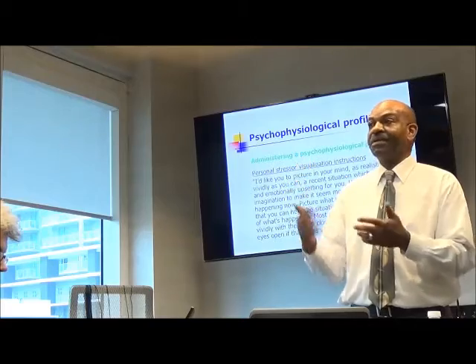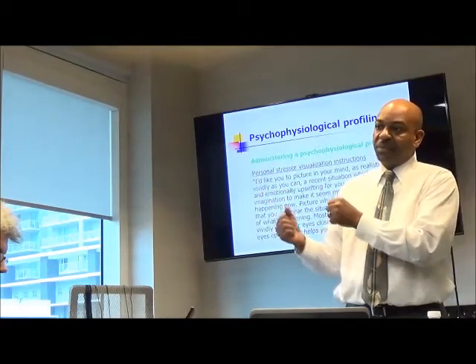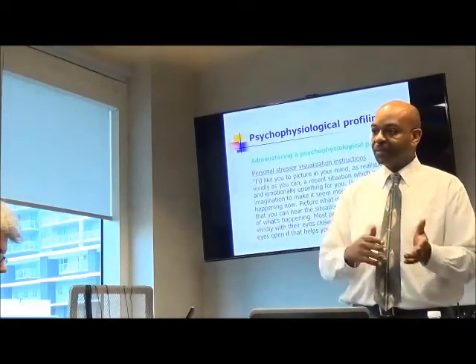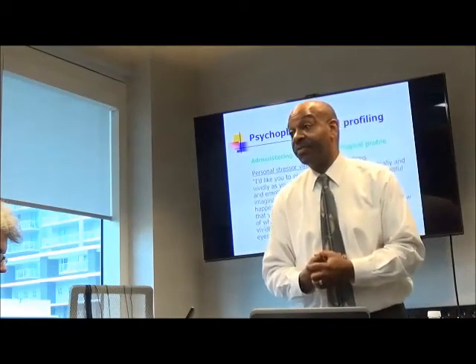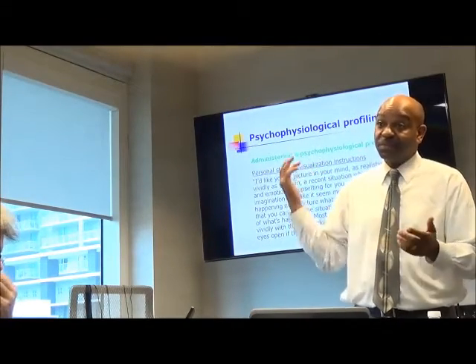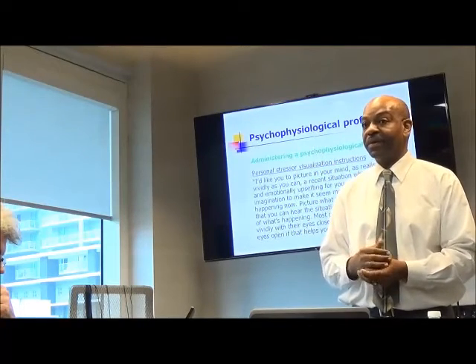You know, and now it's okay, how do I, one, tell the difference between when my muscles are very tense and when they're relaxed, and how do I gain control over both of those conditions? So that's part of what we find out, and that's why you wouldn't assume that would be the case, but sometimes it is, and they see it. You know, it's clear on the graph when it happens.